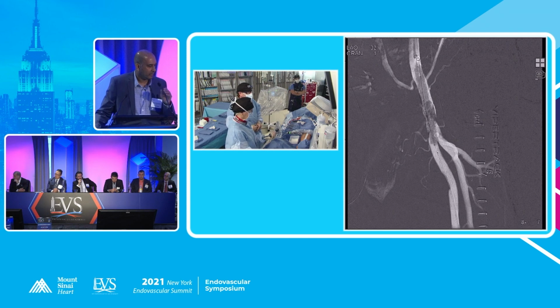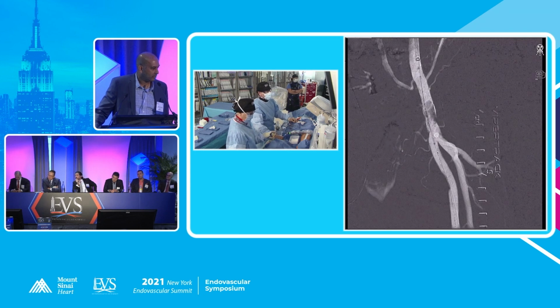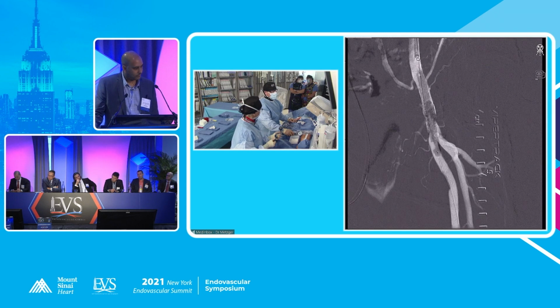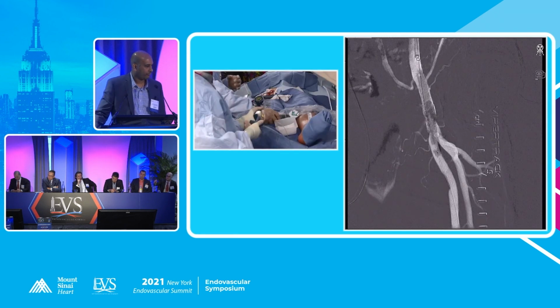Now, one thing we've seen, Chris, in tackling these lesions with Shockwave is that, because a lot of times we would get follow-up ultrasounds on these patients, the ultrasound still looked pretty ugly, even though the flow was significantly improved and the patient's symptoms were improved. Has that been your experience as well? That's a good question. We've done a whole bunch of them, quite honestly, and you're right, they're not all perfect, and it doesn't magically make the calcium completely disappear.